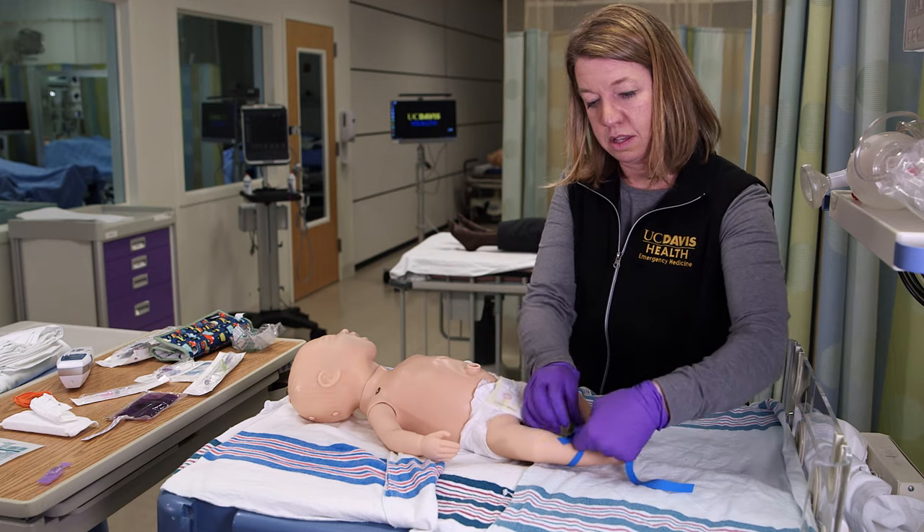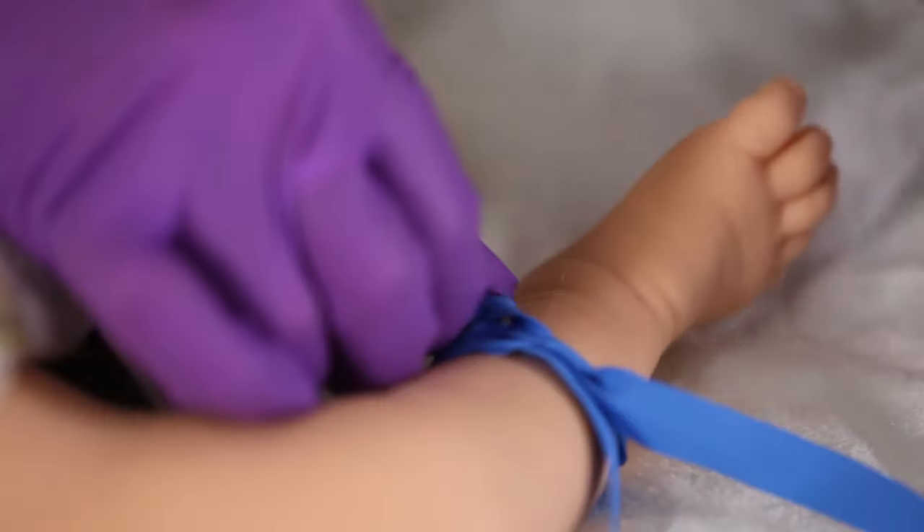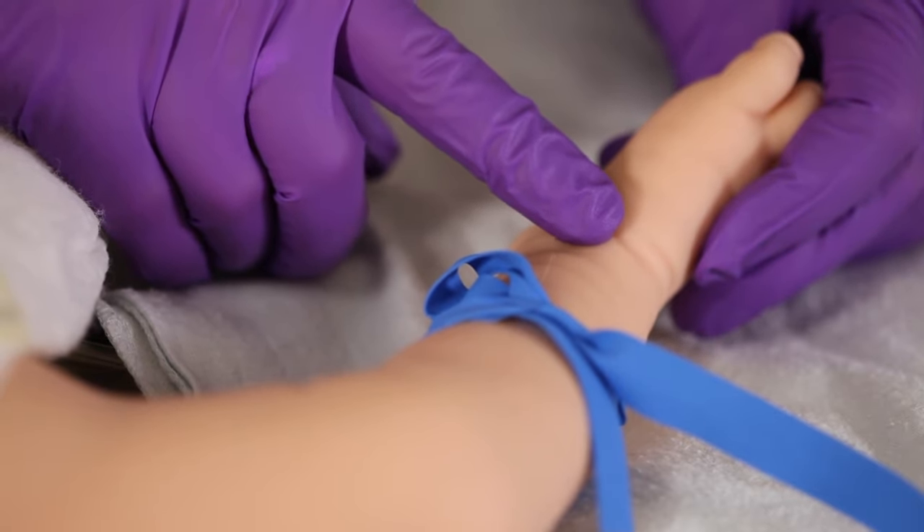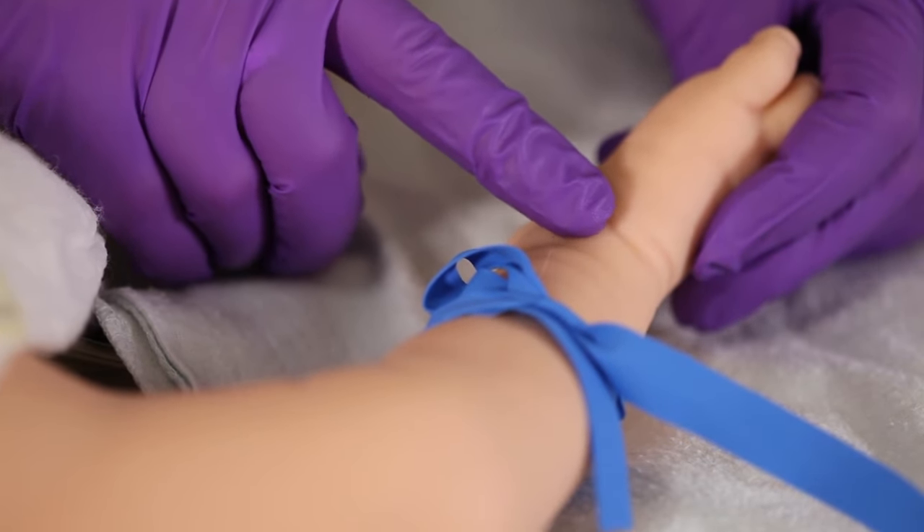The foot or ankle might be another good option. In particular, try feeling for the saphenous vein, which runs just anterior to the top of the medial malleolus.